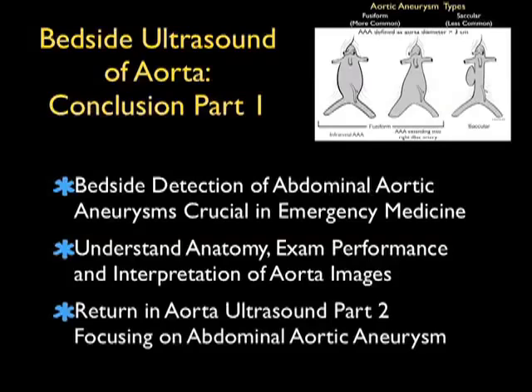So I hope to see you back as Soundbites continues and as we return in bedside ultrasound of the aorta part 2, when we're going to focus entirely on the detection of abdominal aortic aneurysms.